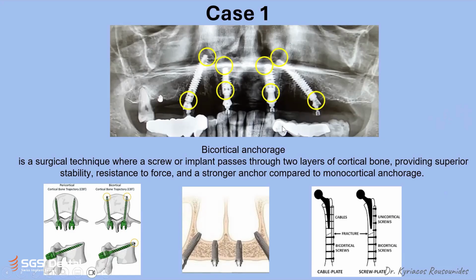Doctor, we will pass this message to our R&D department. Yeah, I already spoke with some of your colleagues, and we are planning to do this. But it's a good weapon in our hands, these longer implants, especially in this kind of cases. But in cases where the implant spins, and either we have a softer bone or we made a mistake.